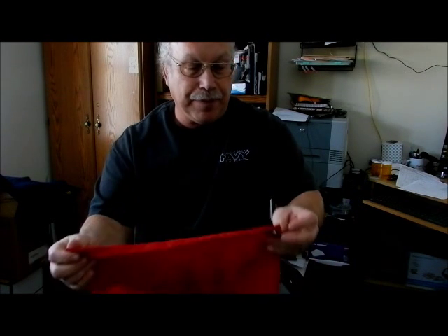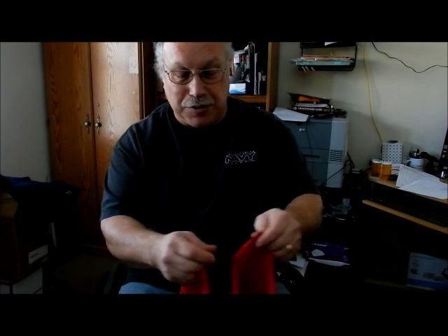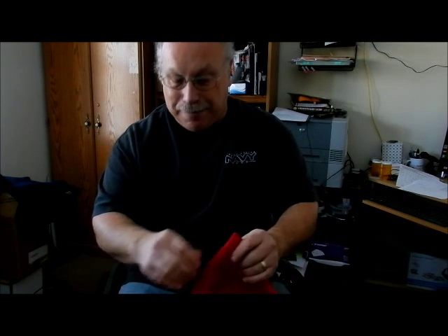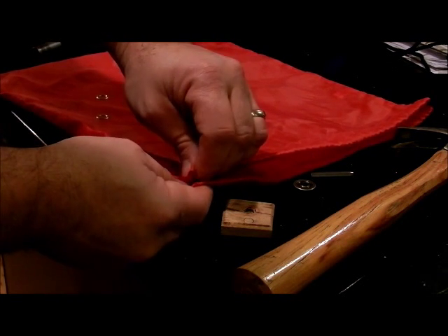So let's go ahead and put some grommets in. You're going to need some. Ace Hardware has some. You're going to buy a package. I have a package down there that's got about 70 of them in there, and by chance they're the same size, which is really nice. So let's go ahead and do that. I want to get both of these together, make them even underneath.